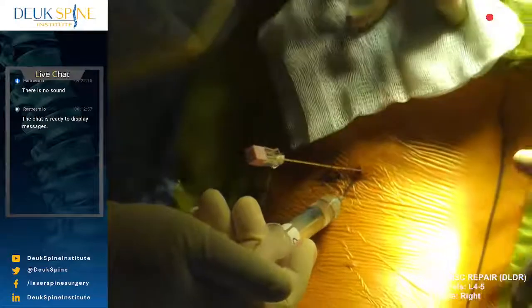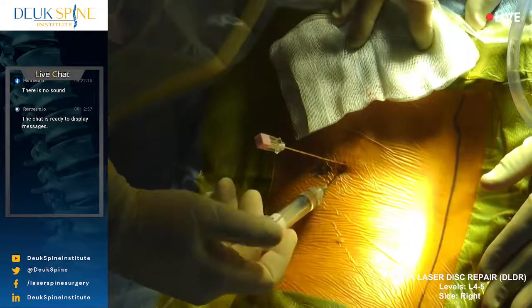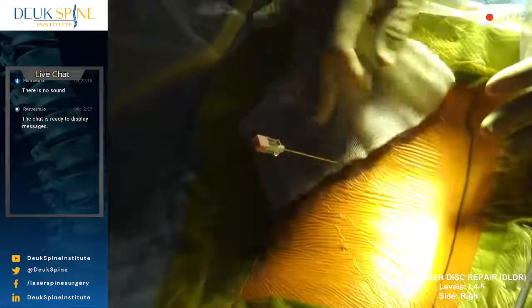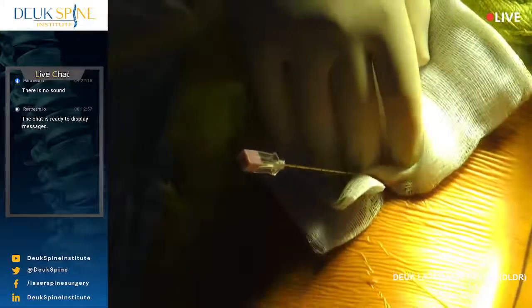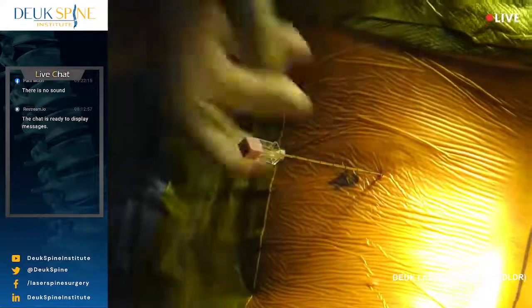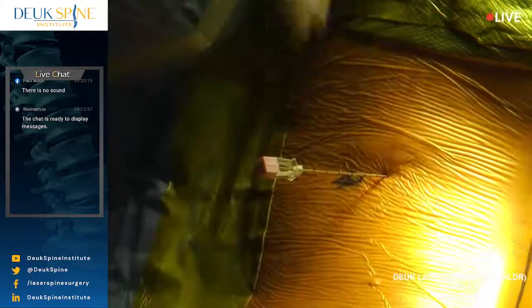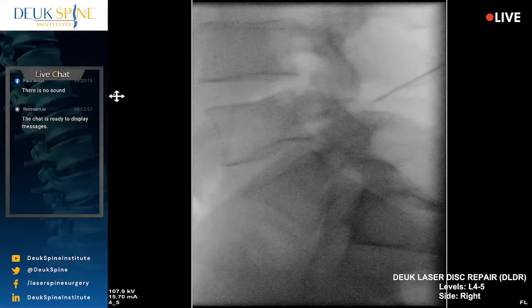I'm giving you a little more numbing medicine in the skin. You're fine. I was hoping if I went through the old site. You're fine. Everything's good. Just lay still for me. Shot? All right, that's better on the X-ray.